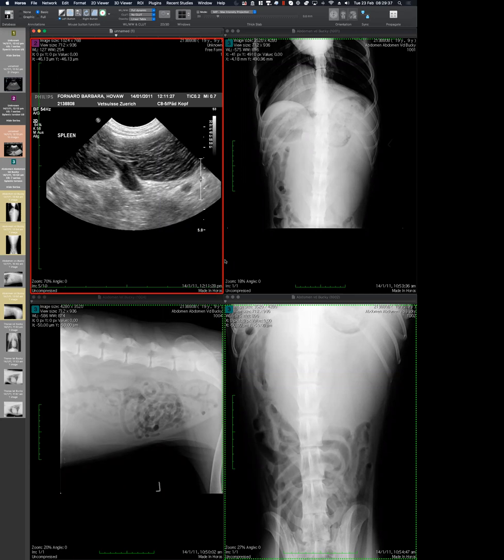In my eyes, probably, if you have the availability of imaging and you have someone that can run an ultrasound, I think the role of imaging in this case is to be better prepared about what you're going to find, to know if you're going to be able to fix it or not. Makes sense? So can any imaging finding prevent you from going to surgery? Makes sense, because you may already realize that it's something that you cannot fix.